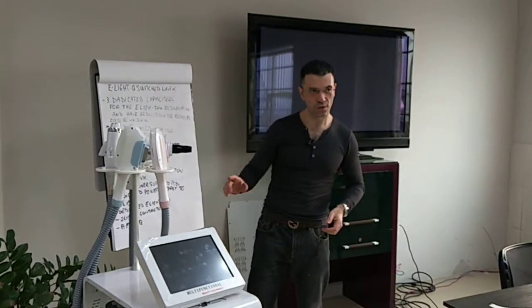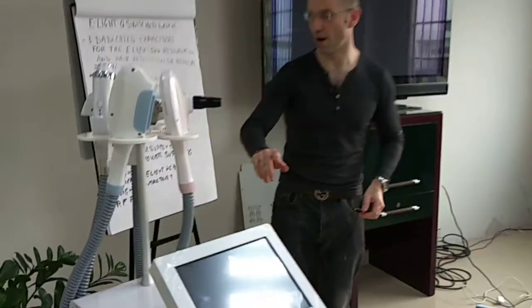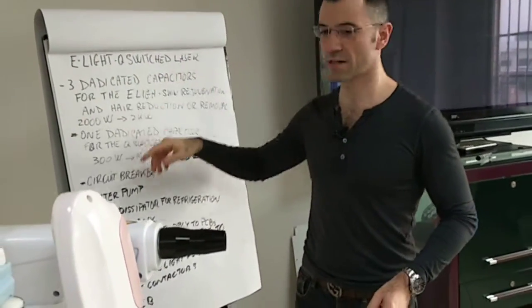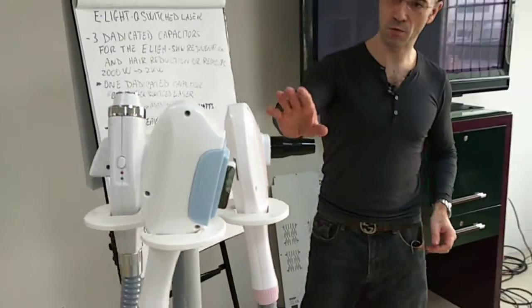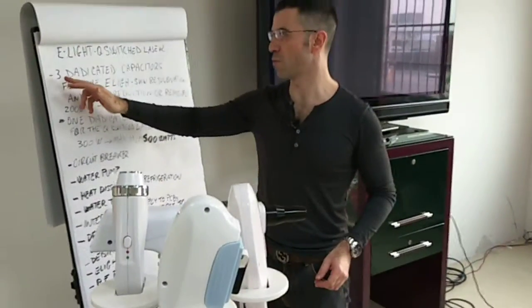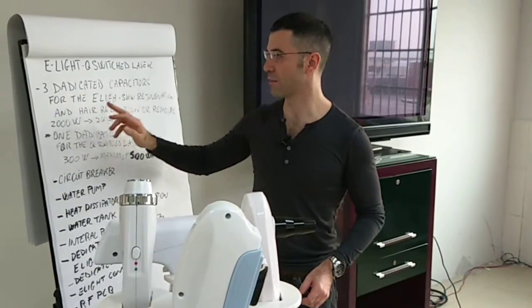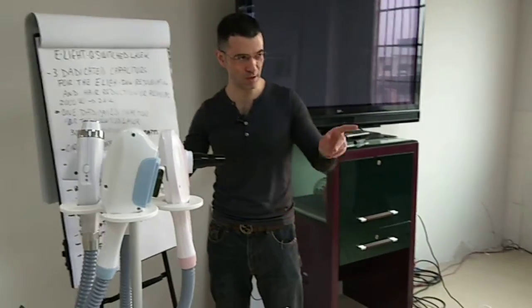In this video, we're going to show you what is inside this particular device. Now, this is the E-Light Q-switch laser RF and also skin rejuvenation E-Light device. Now, inside this device, we've got 3 dedicated capacitors. We're going to list everything, but we're going to show them to you in a second.